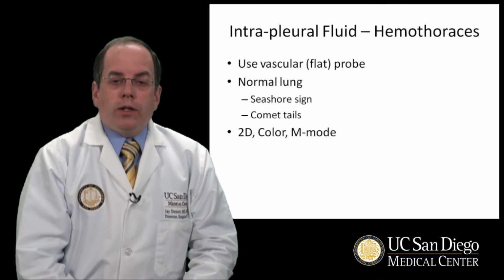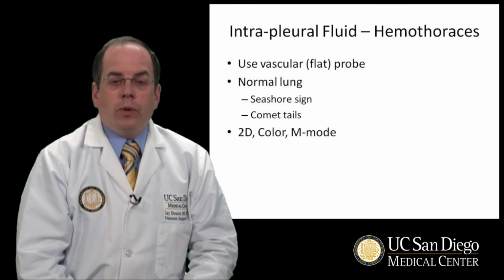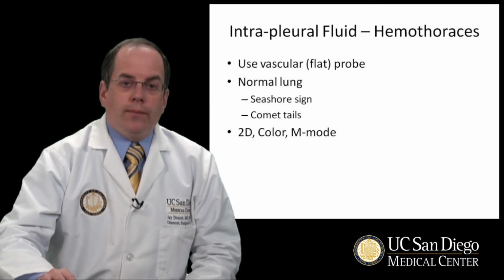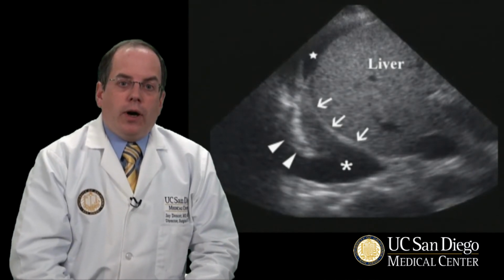There are two findings in the normal situation. One is called the seashore sign using M mode. The other one is called comet tails using 2D. Here's an example of fluid seen above the diaphragm.